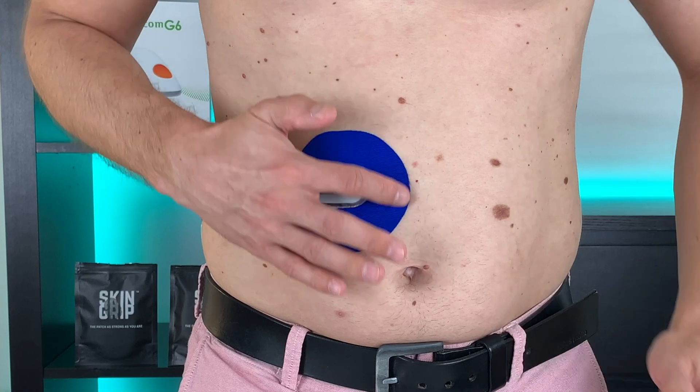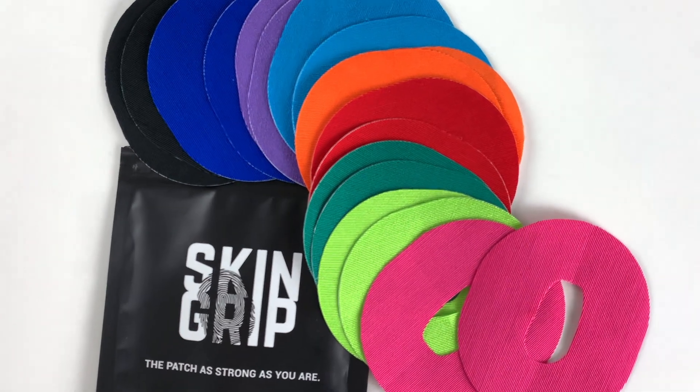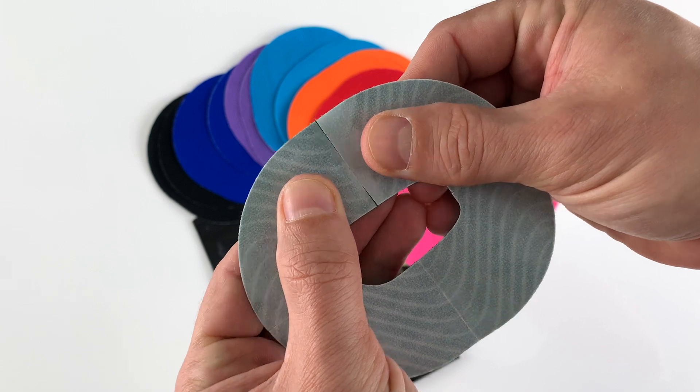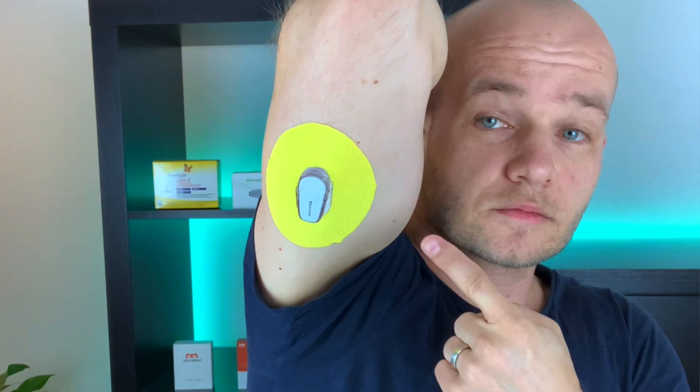For extreme stickiness, use an overpatch to secure and protect your Dexcom. I always do this, especially when I know I'll be active, in a hot climate, sweating, or in and out of water. I like Skin Grip — they stayed on really well even in Brazil. They're quite flexible, stretching with your body, and they don't peel off easily when I move a lot. They also don't soak up a lot of water and dry really fast. The paper tabs on the back are divided into four separate pieces, which makes placement easier. I've partnered with Skin Grip for this video — they give you a special 10% discount if you use the affiliate link in the video description. They now have a rainbow pack with 10 different colors, which I really like. Try them out!